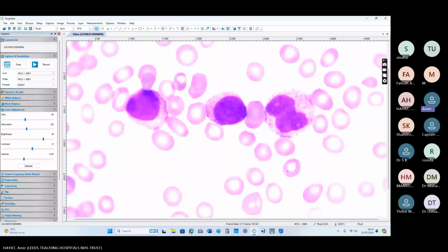So you are the hematology registrar. You have to tell the examiner that you know that this is an emergency. You have to do everything now. You cannot say referral to hematology. No. If you are called about such a blood film in the night, you do not say refer to hematology. You go to the hospital at 3 a.m. in the morning to see the patient and to see the blood film by yourself and to explain to the patient what we are expecting.